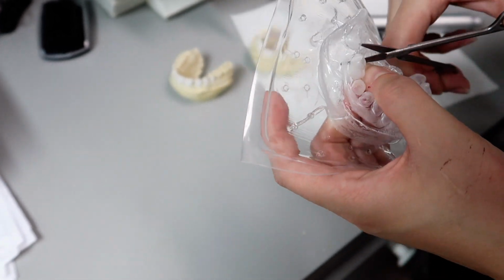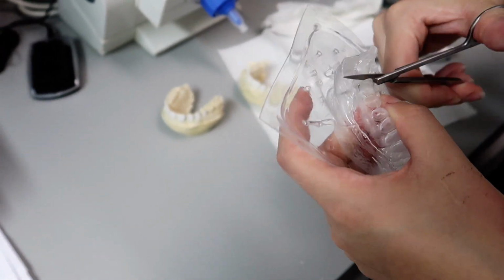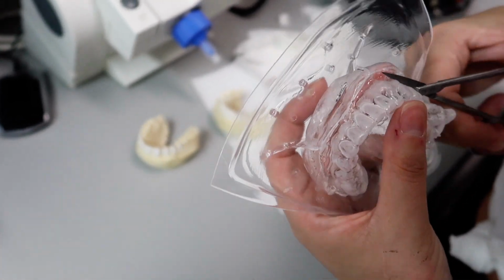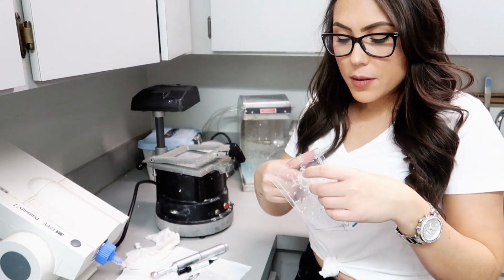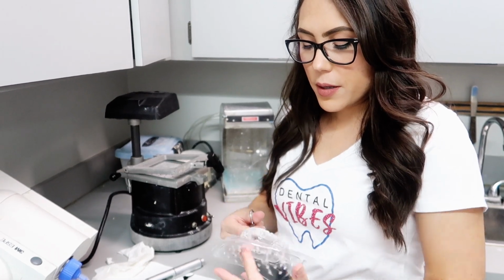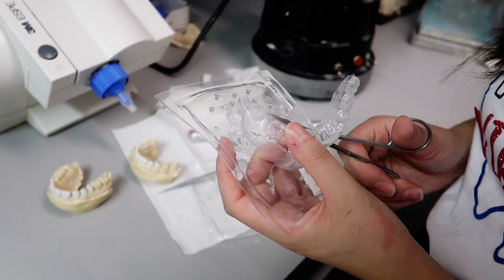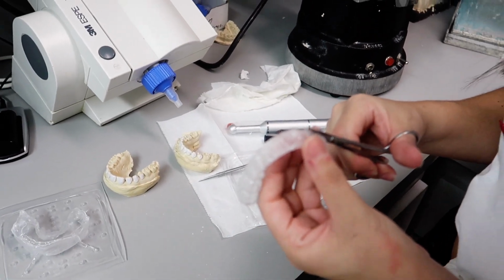Jeez, this scissor sucks. I would have to say, if you want to do the scalloping, you need the proper scissors for that. You can't use any scissors. I cannot work with this. Hold up. I'm back. Got new scissors. Oh my god, night and day. Okay, so I'm just going to go ahead and do a rough cut all the way around. Now I'm going to go ahead and trim very closely.